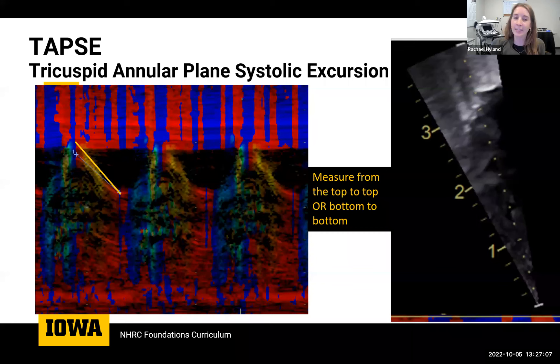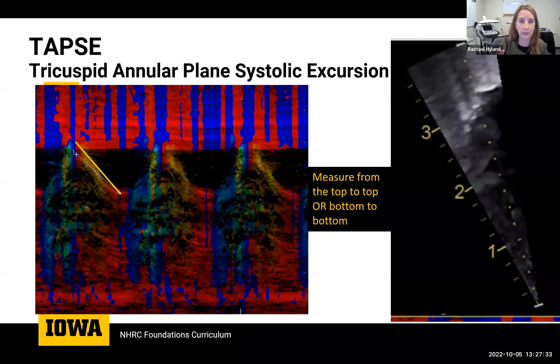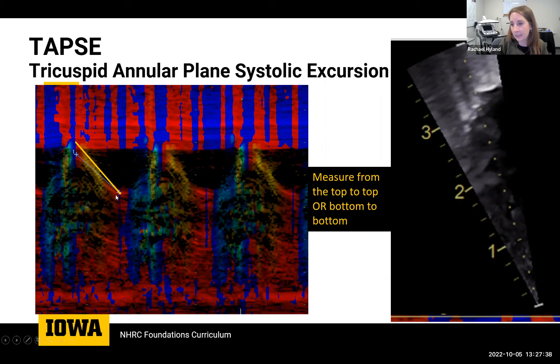The TAPSE measurement is fairly straightforward if it's a good measurement. Alignment here is really critical. It's also important to make sure you're following the same line from the very top to the very bottom. One thing that can help is to take the TVI off while you're doing the measurement to see just the black and white — you can turn up the color to see the gain a little more clearly. Be careful as you align and measure.